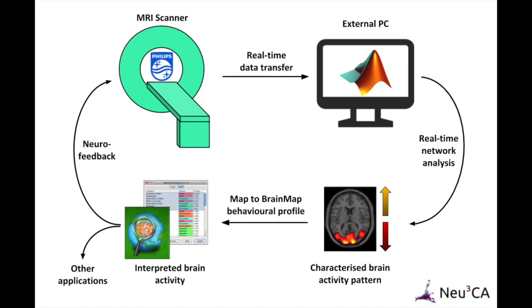And this is the experimental setup with which we do that. We have an MRI scanner from Philips, and we transfer functional fMRI data in real time to an external PC where we do real-time network analysis.